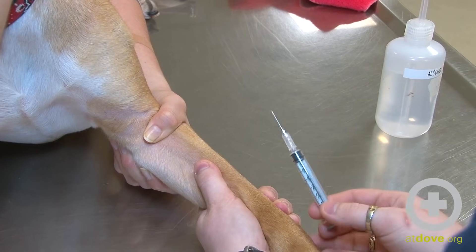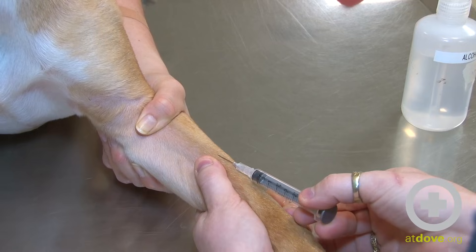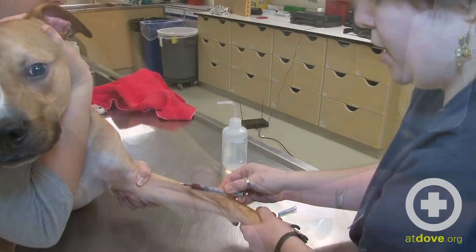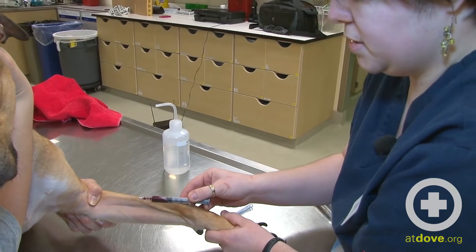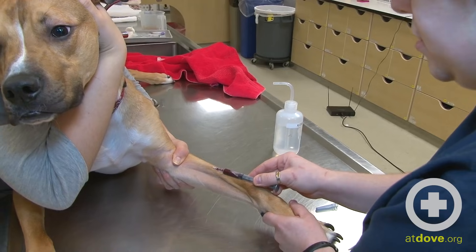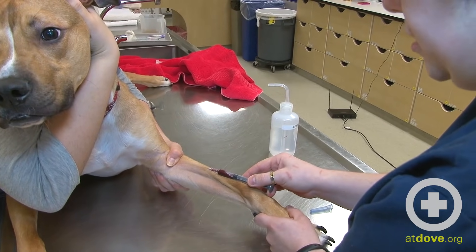I'm going to put my thumb alongside the vein so I know where it is. I'm going to have my syringe bevel up and insert it into the vein and draw back. It can help to put a little bit of pressure on the paw — kind of give it a squeeze — to help the blood flow through that vein so that you can get a little bit more or a little bit faster into your syringe.